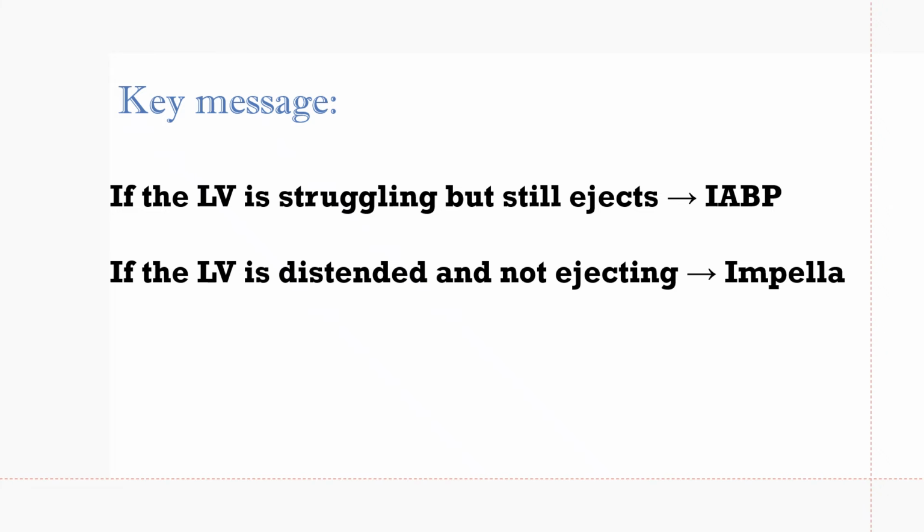Our key message for this lecture: if the left ventricle is struggling but still ejecting, use intra-aortic balloon pump. If the LV is distended and not ejecting, use Impella.